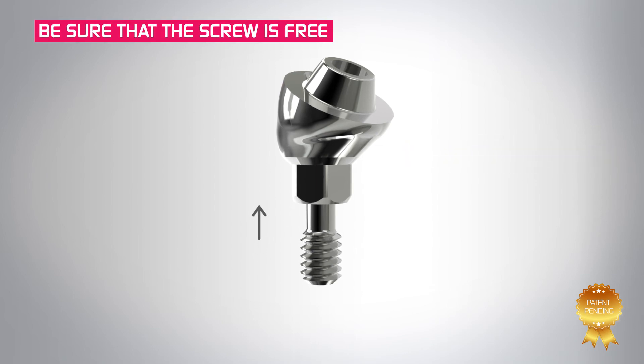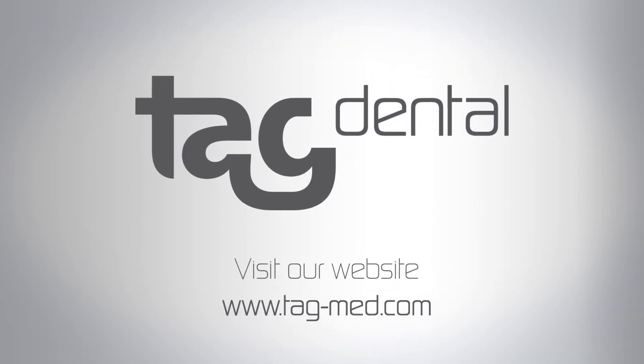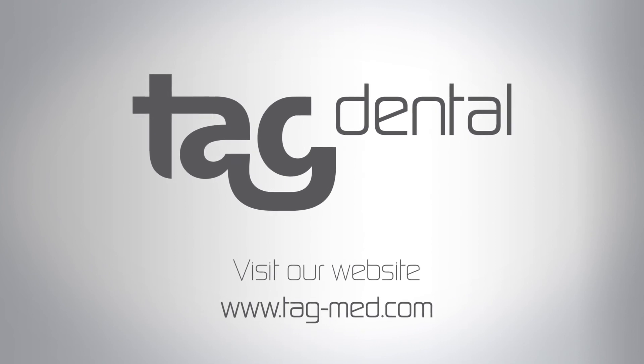Making sure that the screw is freely moving up and down within the abutment. Multi-unit abutments. Intelligent design. Superior engineering.